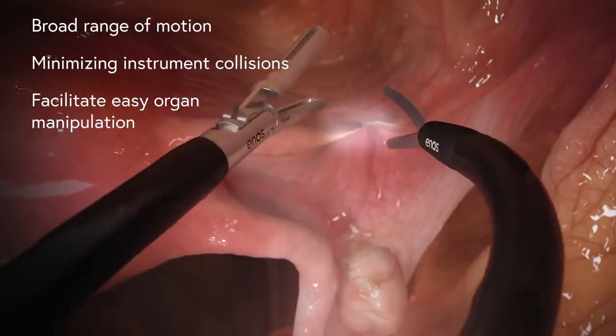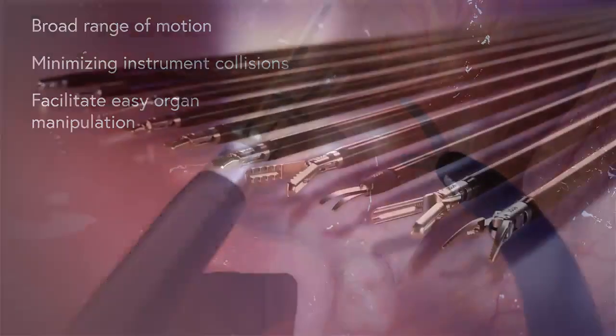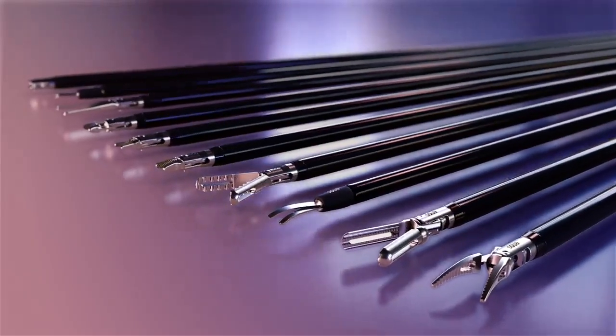With an initial suite of 10 unique robotic instrument tips, surgeons can operate with precision for a variety of procedures.